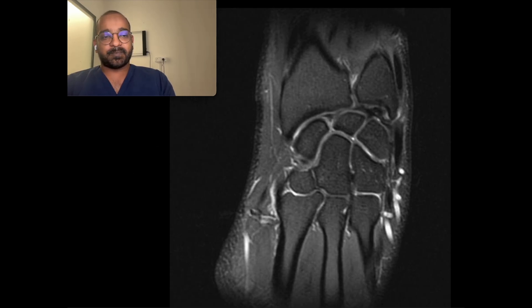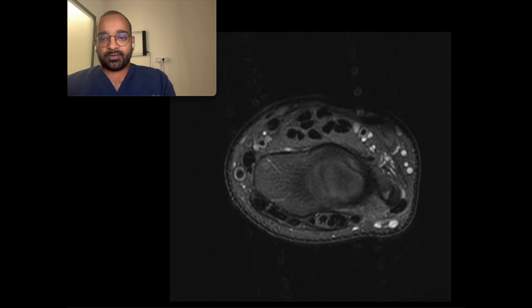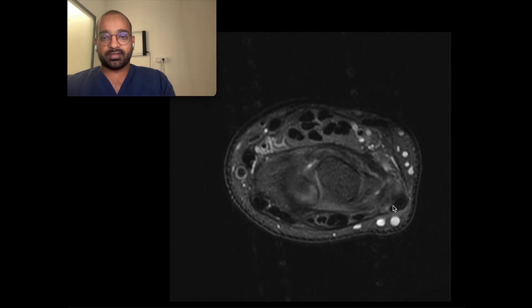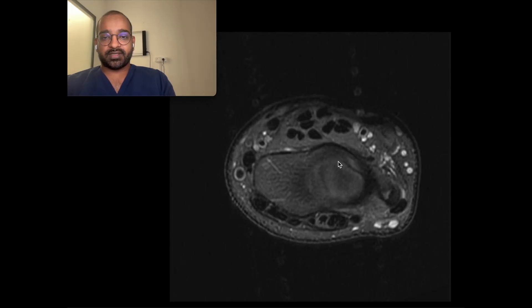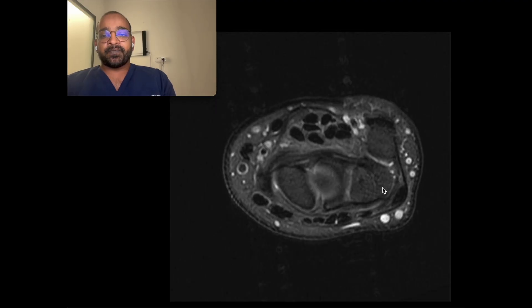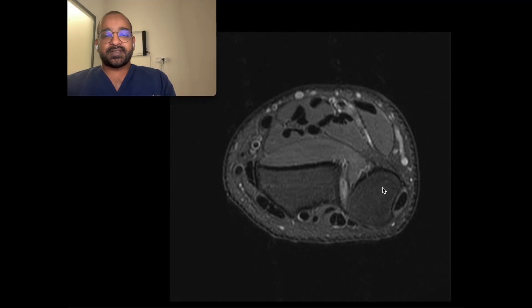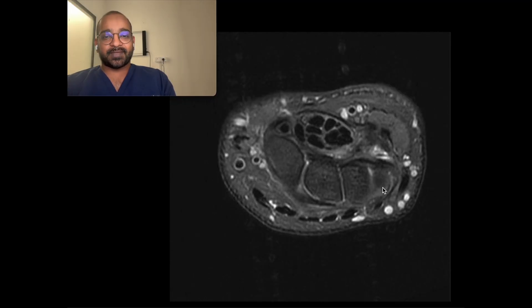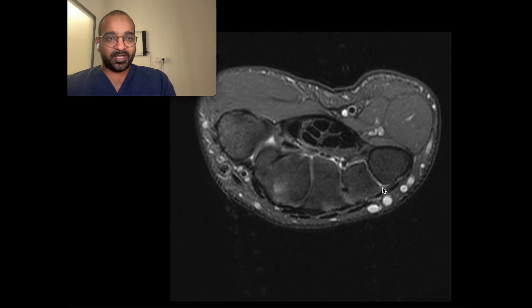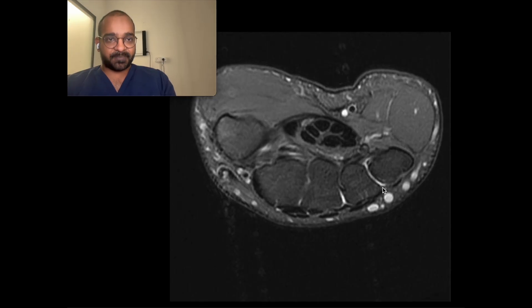Let us look at the same TFCC on axial image. This structure here is the TFCC — the disc proper — and this entire structure is the TFCC on the axial image. That is a brief overview of the anatomy of the wrist.